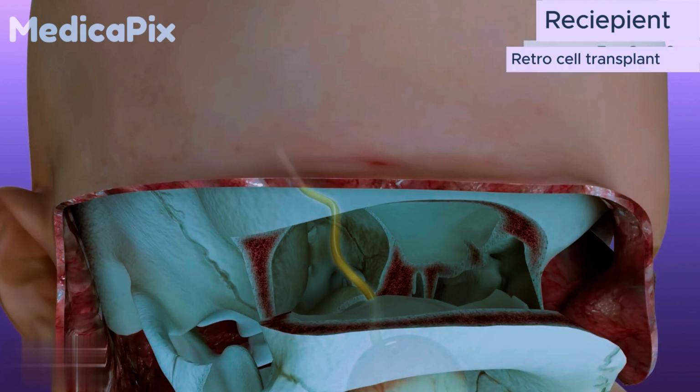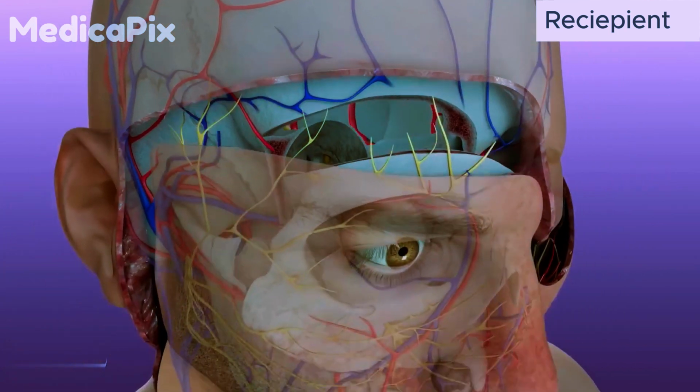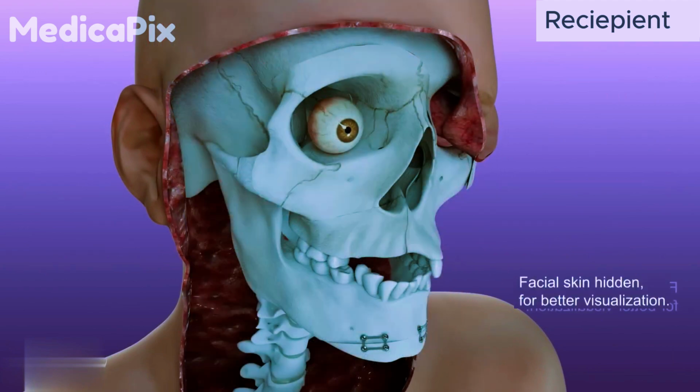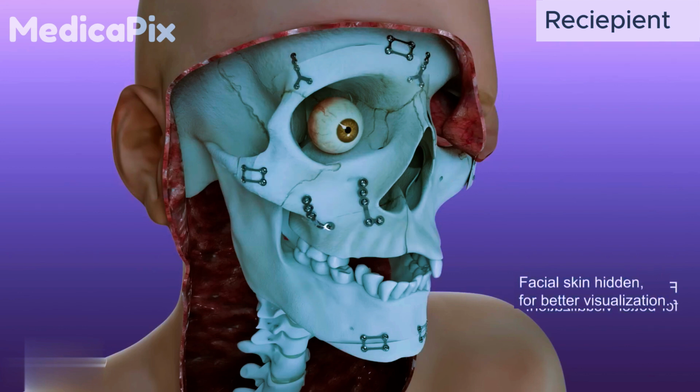Bone marrow that was harvested from the donor and processed preoperatively to isolate CD34 stem cells were then brought into the operating field and injected along the side of the optic nerve coaptation to stimulate nerve regeneration. The donor midface and orbital zygomatic bony subunits were then affixed to those of the recipient using low-profile titanium plates and screws, confirming anatomic replacement of all bony subunits and fixation into the appropriate positions.